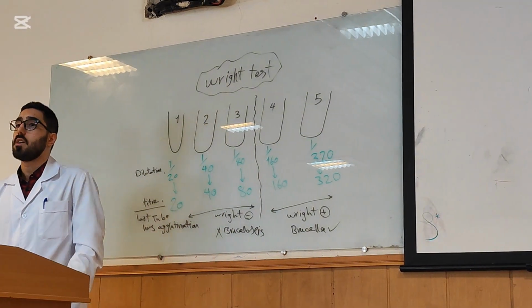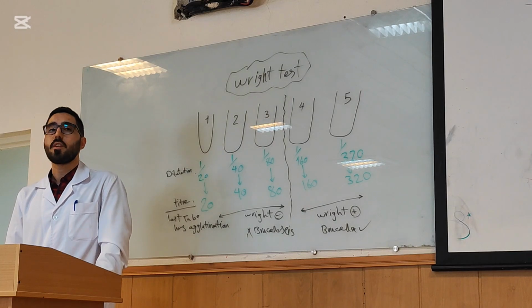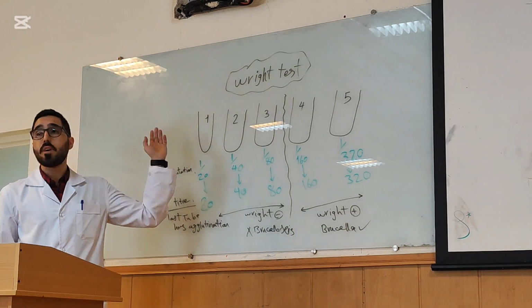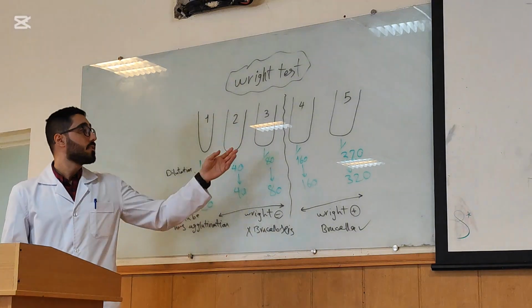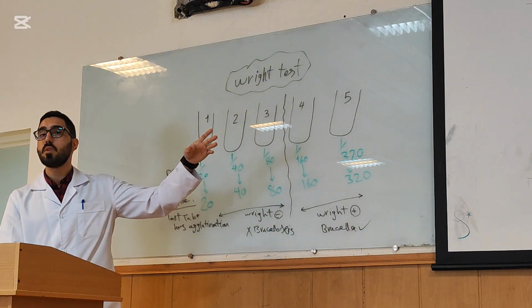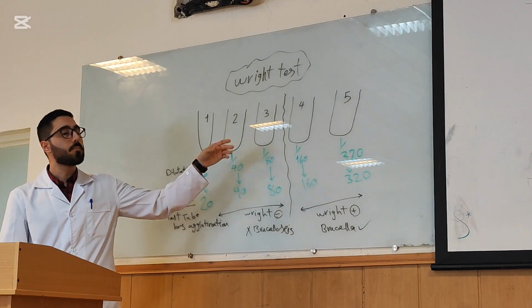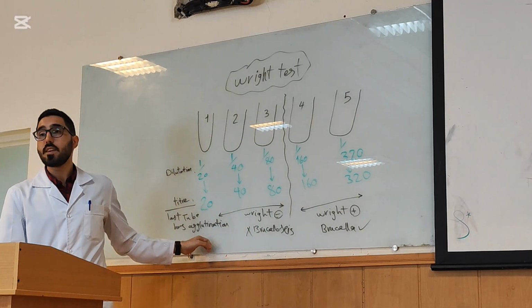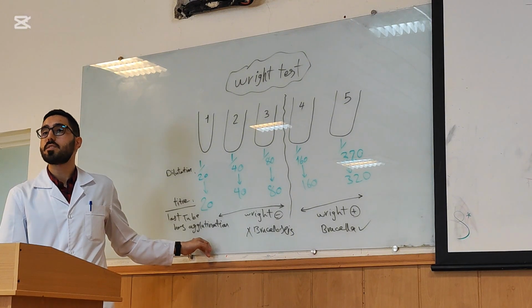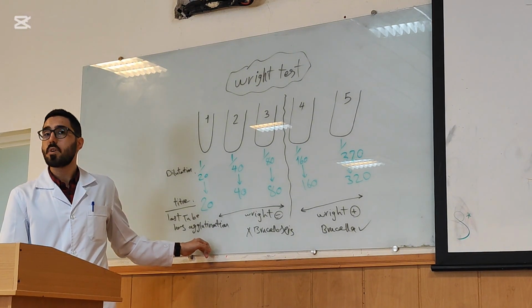So, in your exam, I explain again. In your exam, you have a rack in your station, and the rack has 5 tubes, numbered 1 to 5, and you must report the titer on your paper with the last tube with agglutination. Any question? No. Okay.